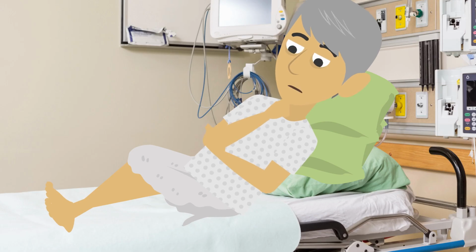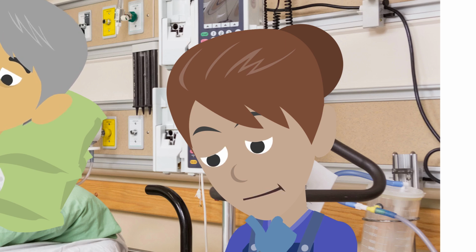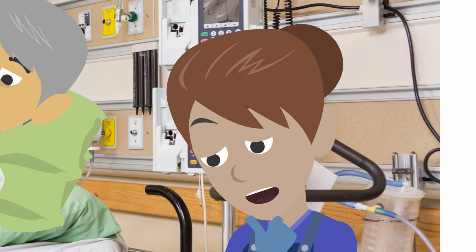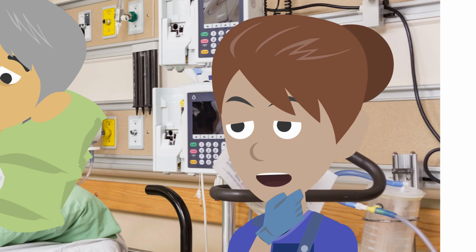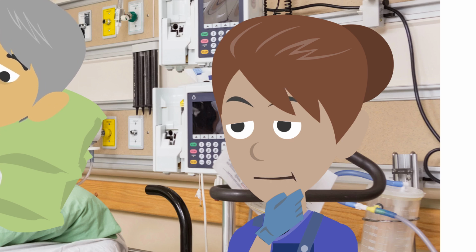Thank you. As I mentioned before, I need to check that the tube's in your stomach using the pH indicator strips as a guide. If the tube is in your stomach, the pH will be 5.5 or less, which is acidic. That will confirm that the fluid is stomach fluid and the tube is correctly placed. The last thing I'll do is to put a spigot at the end of the tube so fluid doesn't leak out.